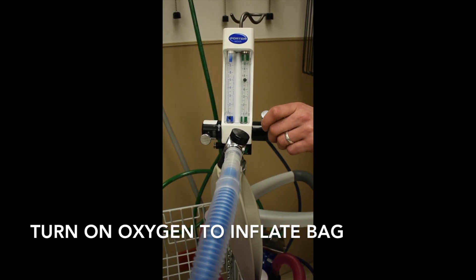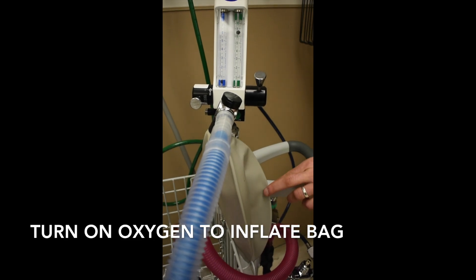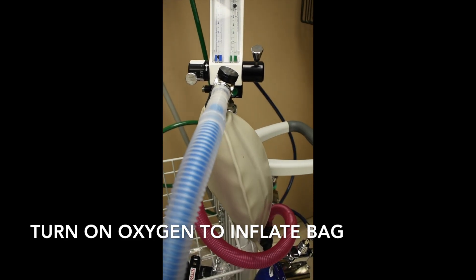Next, administer oxygen to the patient by elevating the oxygen knob. You will know oxygen is being delivered because the gray bag will inflate.